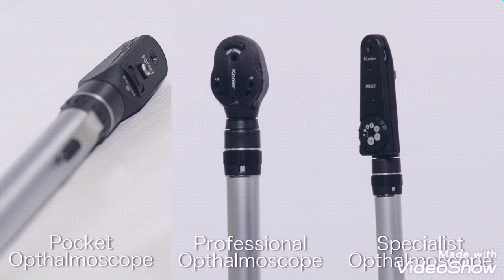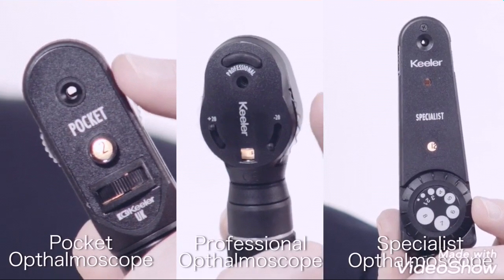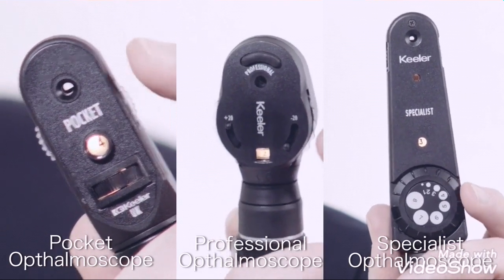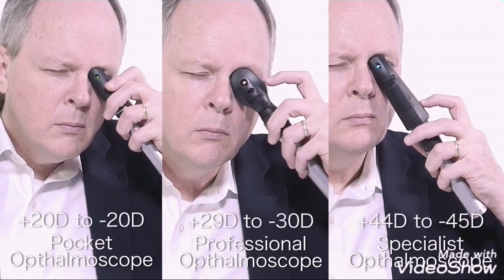Let's begin with the ophthalmoscope line. The lens wheel is rotated to select the required lens. Keillor ophthalmoscopes include a comprehensive lens range. The lens ranges for our ophthalmoscope line are the following.